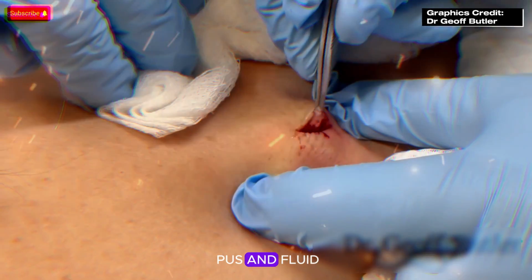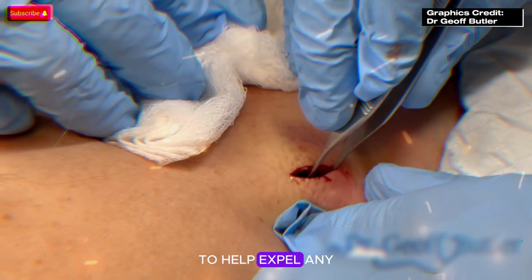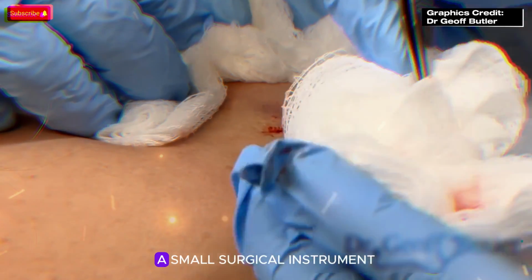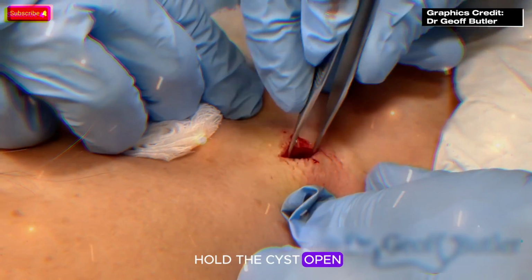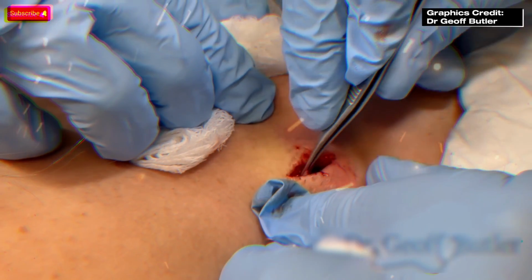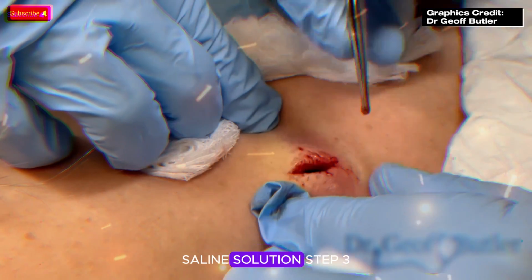Step 2. Expressing the pus and fluid. We gently press on the surrounding area to help expel any remaining pus. In some cases, a hemostat, a small surgical instrument, may be used to hold the cyst open and remove stubborn debris. If the pus is particularly thick, we might need to flush the cyst cavity with a sterile saline solution.